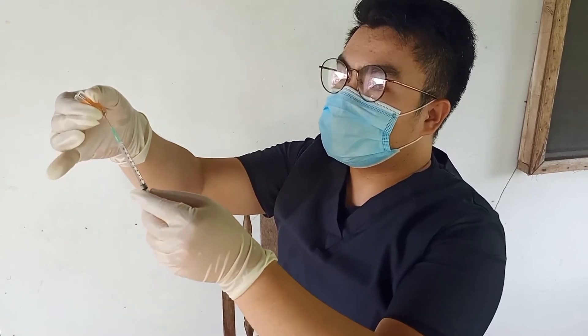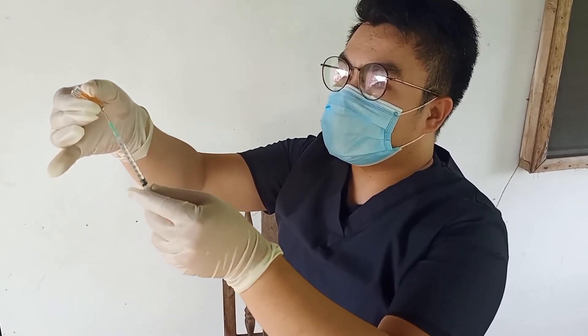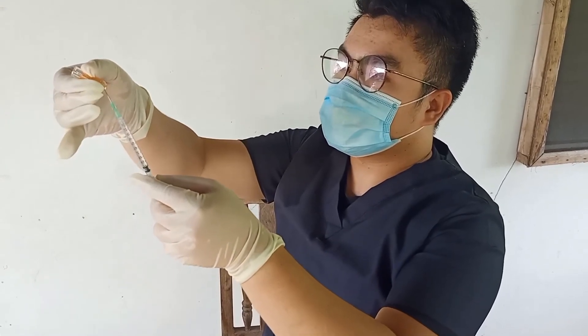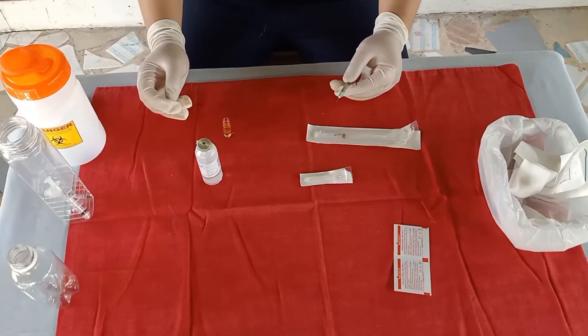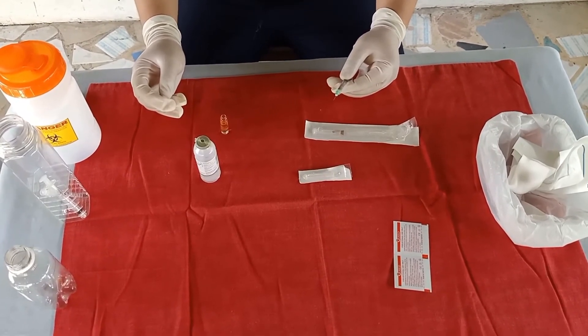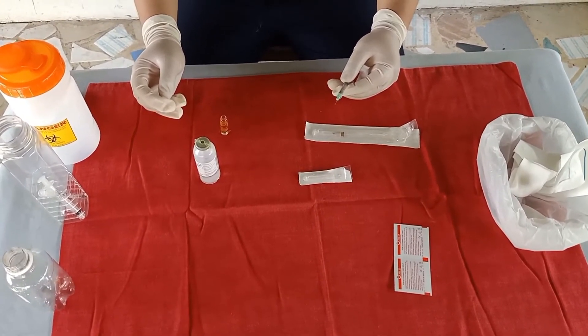I will be withdrawing 0.1 cc of medication. Replace the cap over the needle using the scoop method, thus maintaining the sterility.